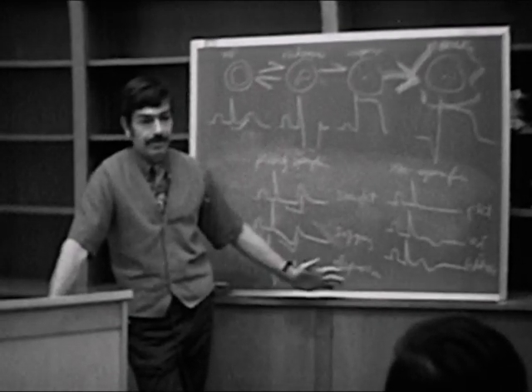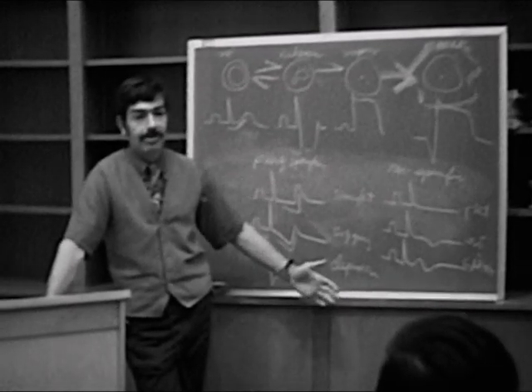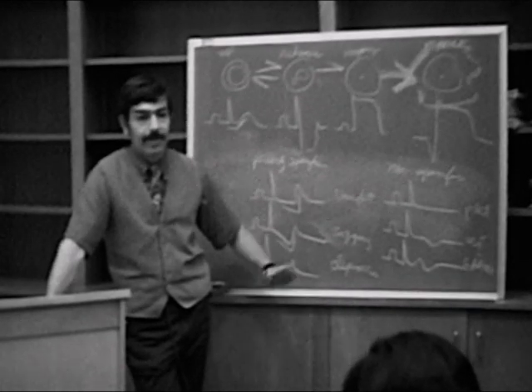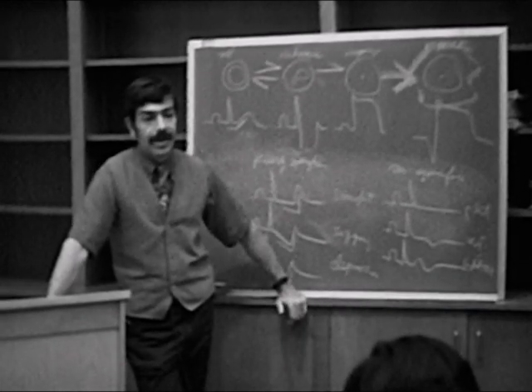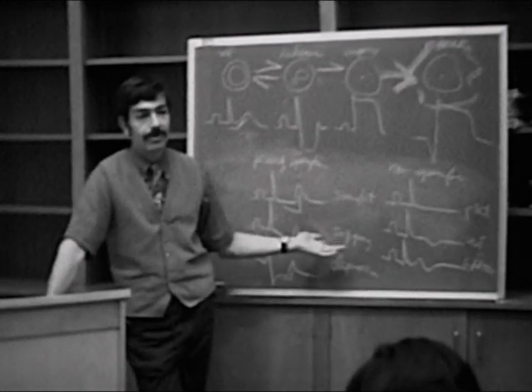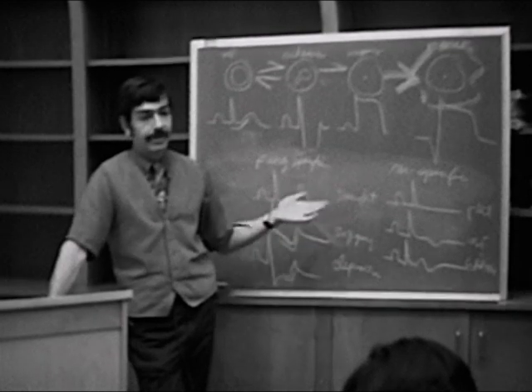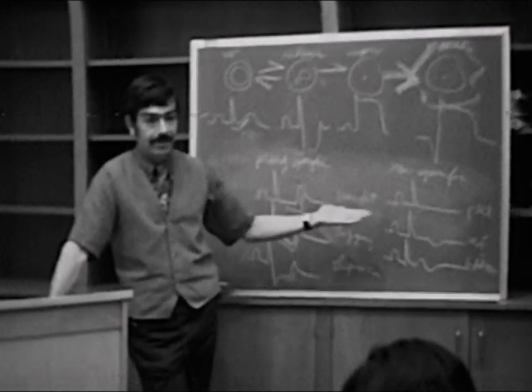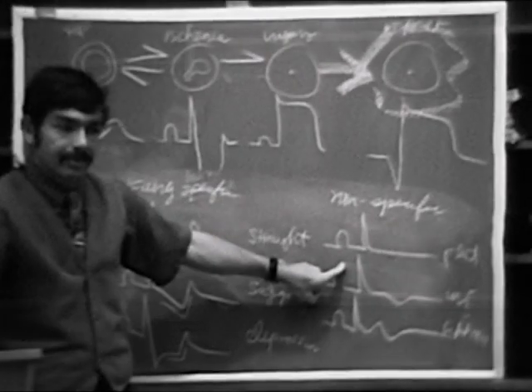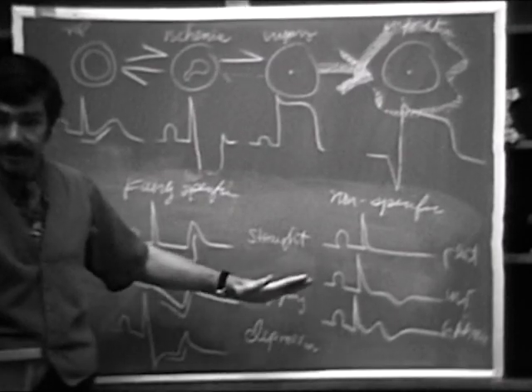This may indeed reflect coronary disease. You just don't know. It may also reflect an electrolyte problem. It may reflect pulmonary problems, central nervous system problems, metabolic problems, or the patient may have a myocardial problem that has nothing to do with coronary disease. You just don't know. You have to call this non-specific. But the point is that this does not mean that this change is not due to coronary disease. In other words, this may very well be reflecting ischemia, but it may, on the other hand, not. You just don't know.